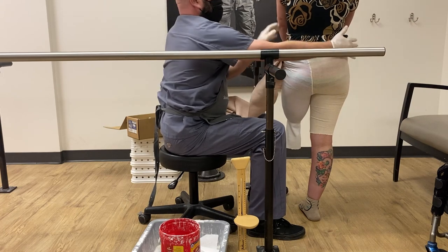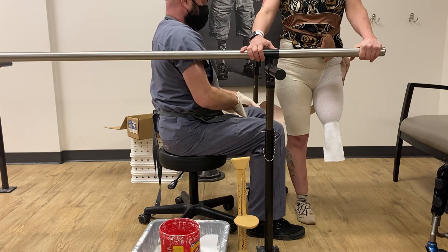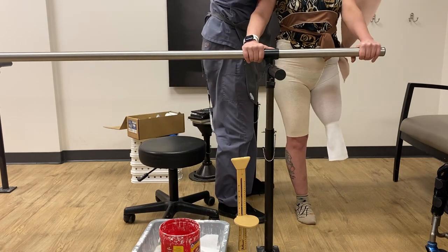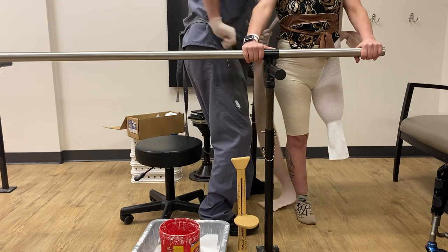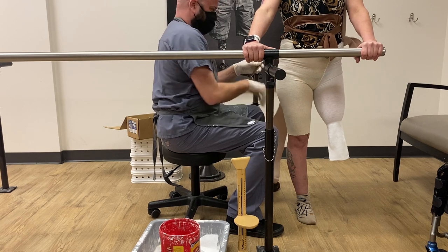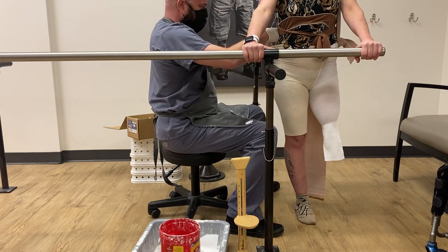When is my check socket gonna be ready? He says he's gotta cast me first — and that it's gonna be a couple months. A couple months? Alright, well, I'll see you in July. I'll see you in hell!